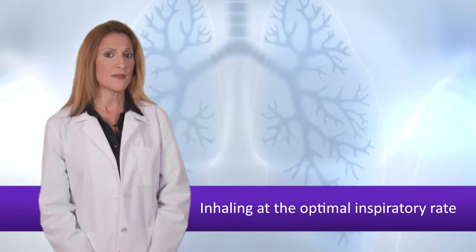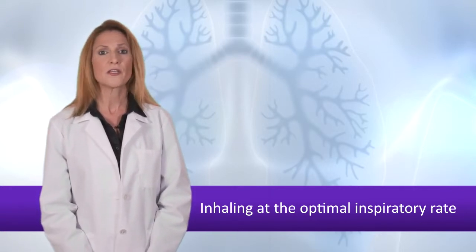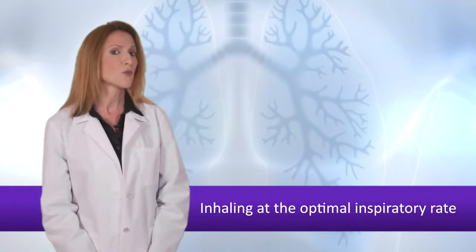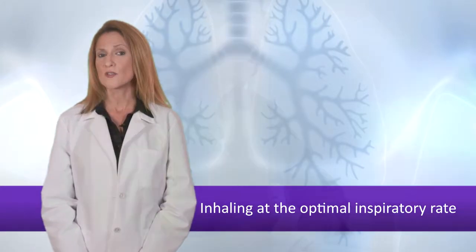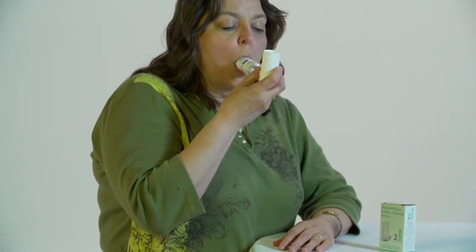An alternate method is for the patient to purchase their own device. After initial instruction, the patient takes the device home. They practice inhaling on the training device once or twice before actually inhaling each dose of medicine. After they feel comfortable with the correct rate, they continue to use the trainer weekly or monthly to be sure that their inhalation rate is still correct.